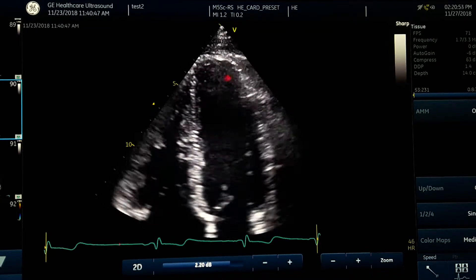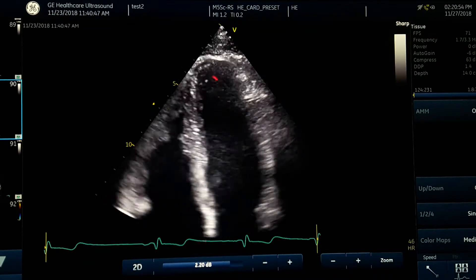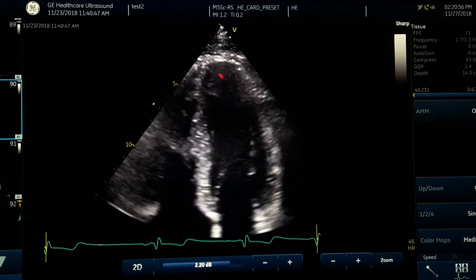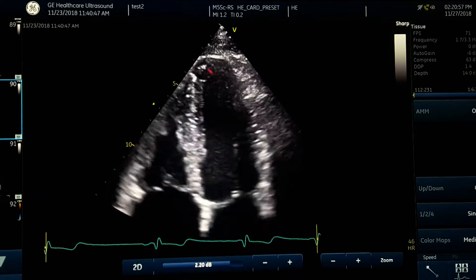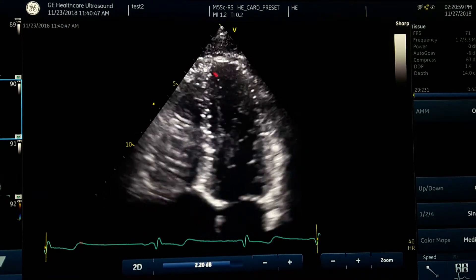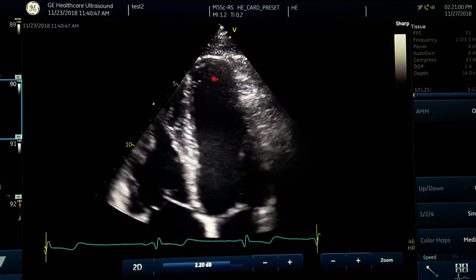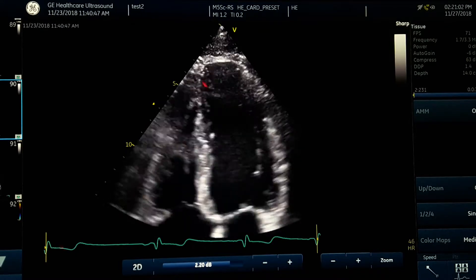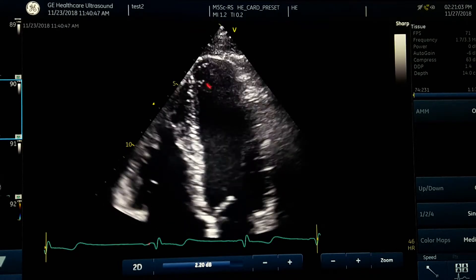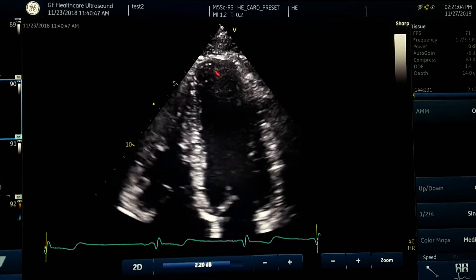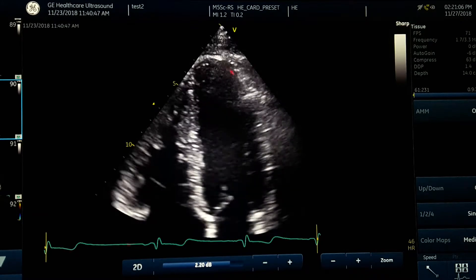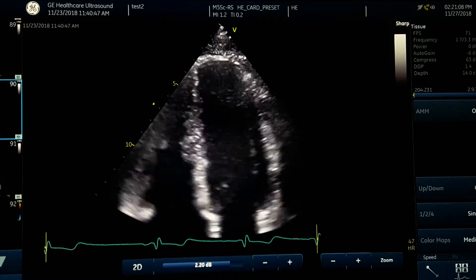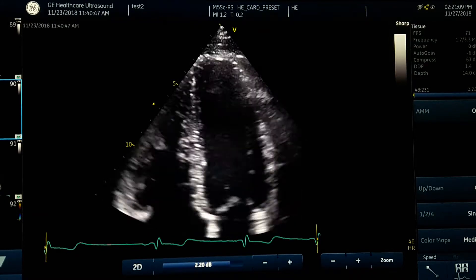Second, if there is a thrombosis or mass, you would not expect the apex to move and contract — it should be akinetic. However, as you can see here, the endocardium becomes thickened and the apex contracts very well, which argues against a true thrombus.